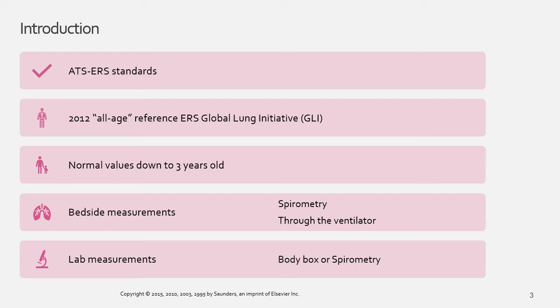It's important that these guidelines and standards are adhered to. The Pulmonary Function Laboratory Equipment Quality Control Program needs to follow these recommendations and ensure accurate test results regardless of the size and age of a subject being tested.